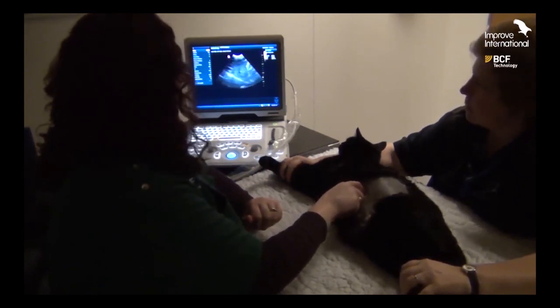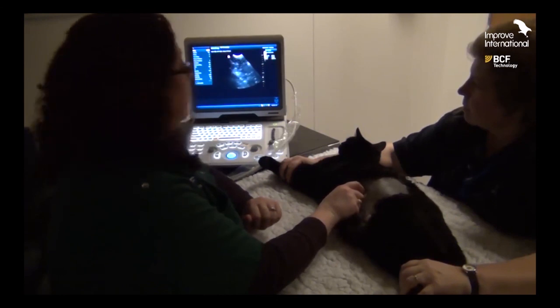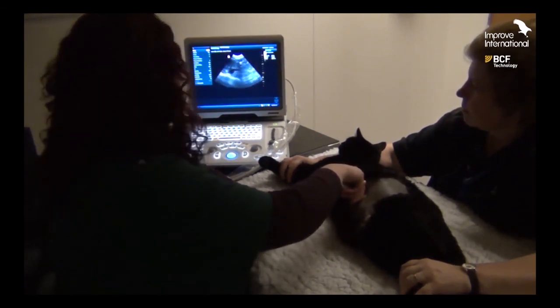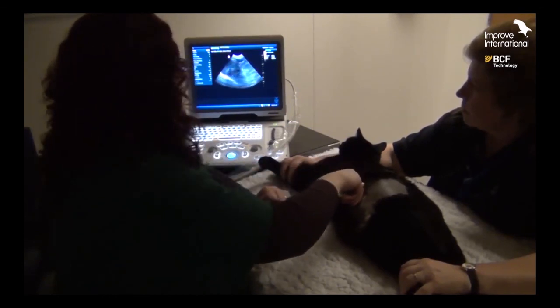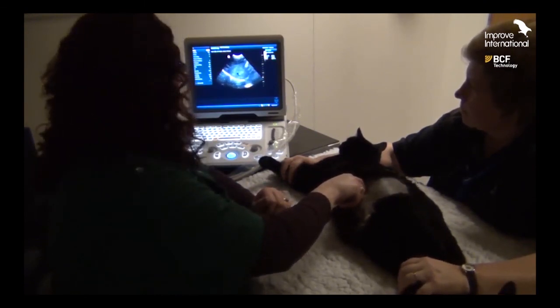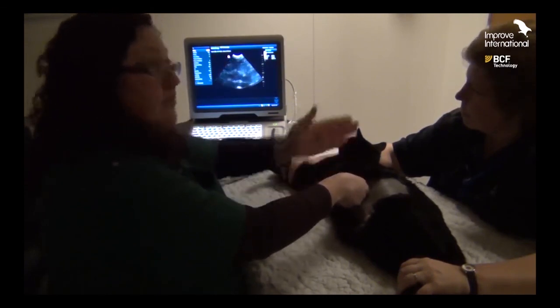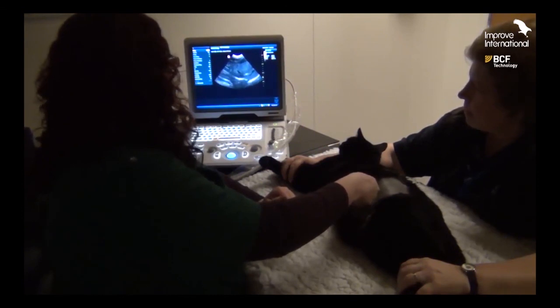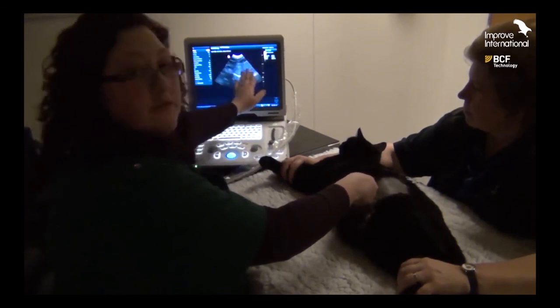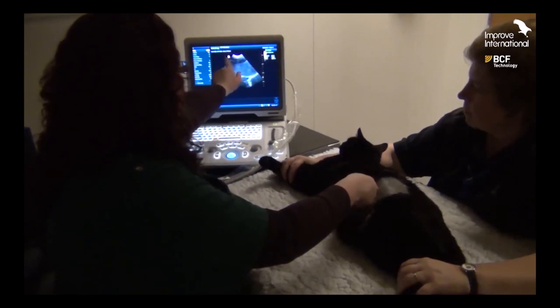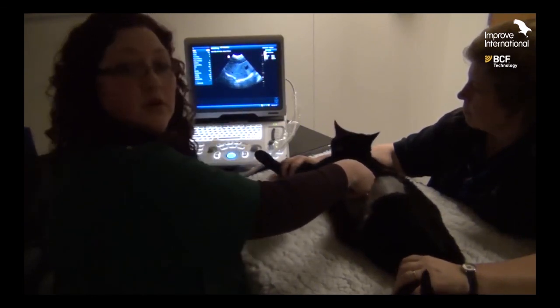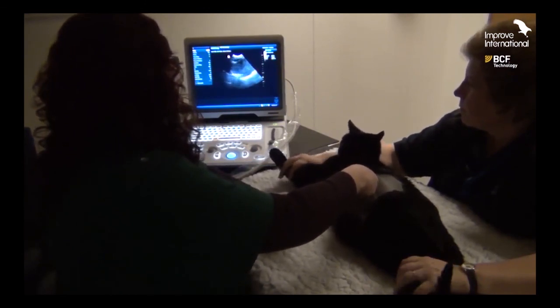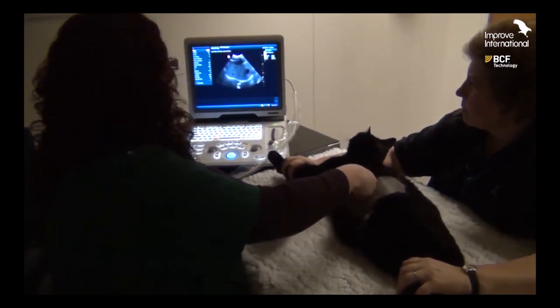So if we fan up until the liver disappears, and then fan down, the gallbladder will come into view — as we can see there — until it disappears completely. Then we come back to our neutral plane. We'll then rotate with the thumb up to the sky, so the thumb mark is now pointing upward, and fan cranially. We can see the vasculature within the liver. I actually want to see more of the screen on the right-hand side, which is away from the mark, so I'm going to point down away from the mark. We can continue to fan cranially, then fan back caudally, and now we have seen the liver.